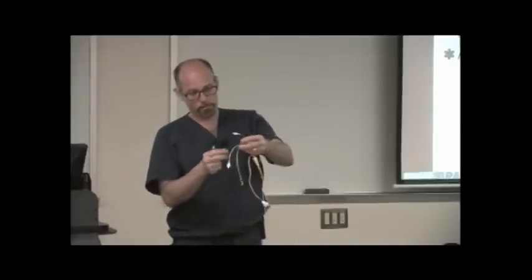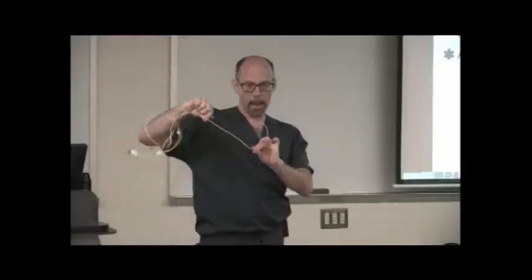So 3 lumens. The blue lumen, if I trace it all the way down to the end, when the catheter is in position, the blue lumen opens up in the right atrium. So if I hook a transducer up to it, I can monitor right atrial pressure with that. The medial lumen actually opens up right around the tricuspid valve. It's typically used for infusing vasoactive medications. It's a really teeny tiny little line, so I can start up a drip at a really low infusion rate, and it's going to quickly get into the patient because it's so tiny. Right?